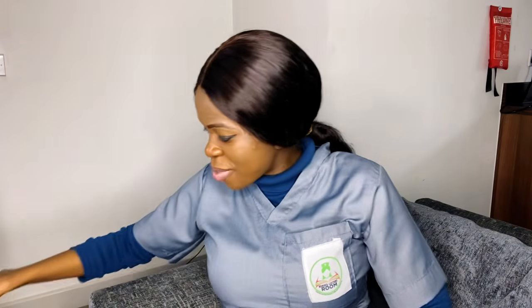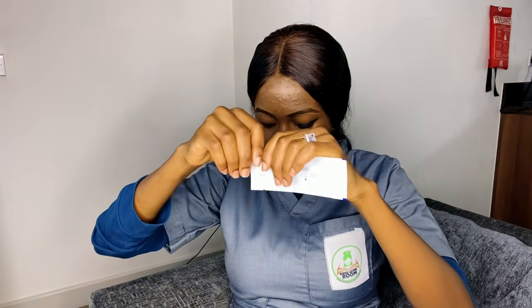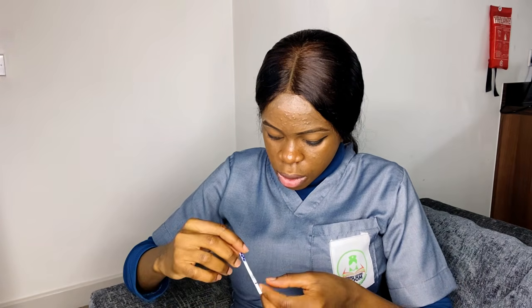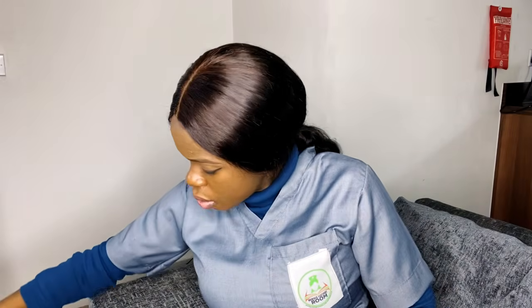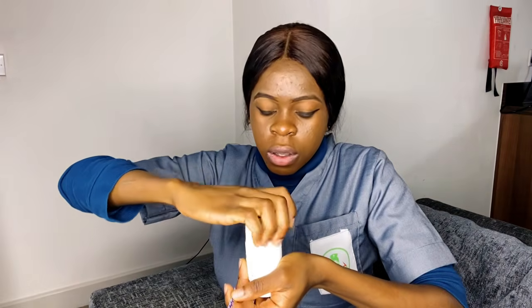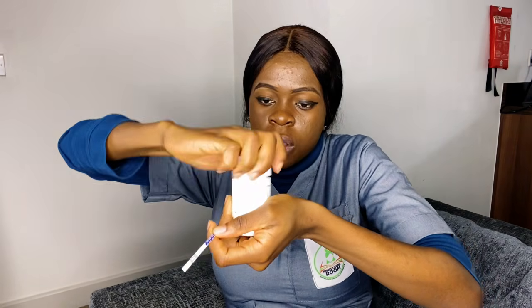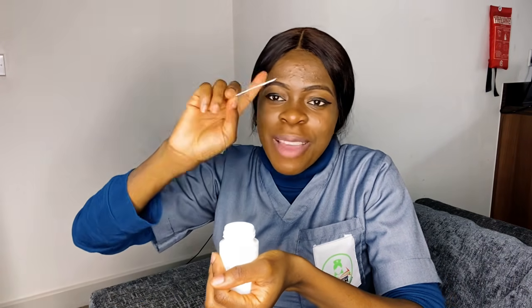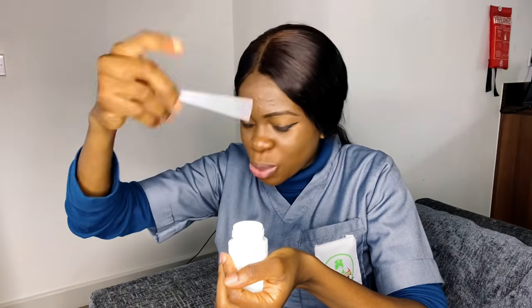It's here with me. So I'm going to open the second strip. This is the second strip. I've opened the second strip. Like I earlier said, this you discard. Then this is my second sample. So this is not real, it's not real life. Don't go implicate me. This is just improvising to teach you how to do it in case you are at home.